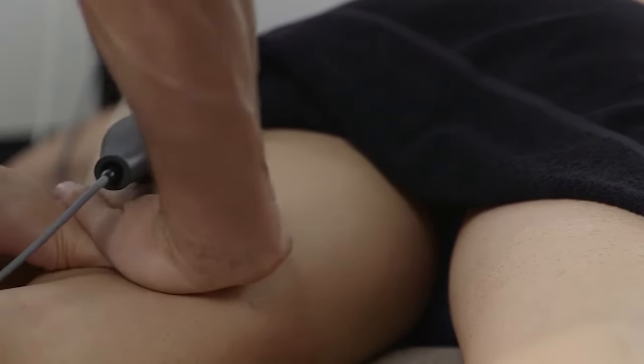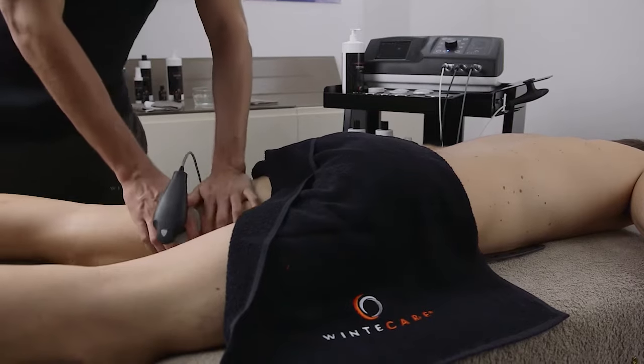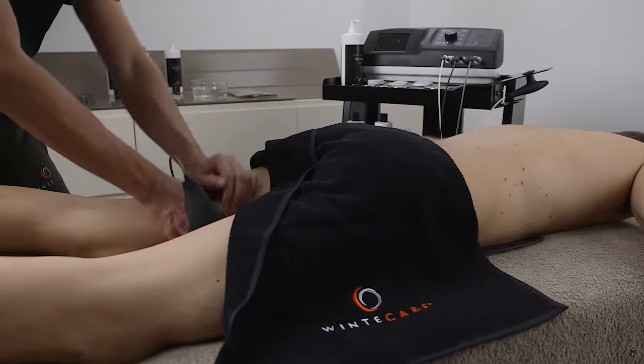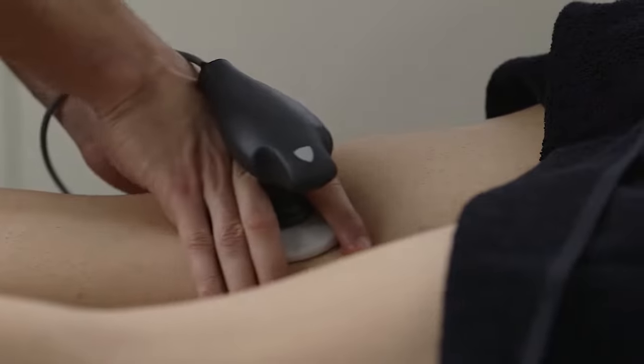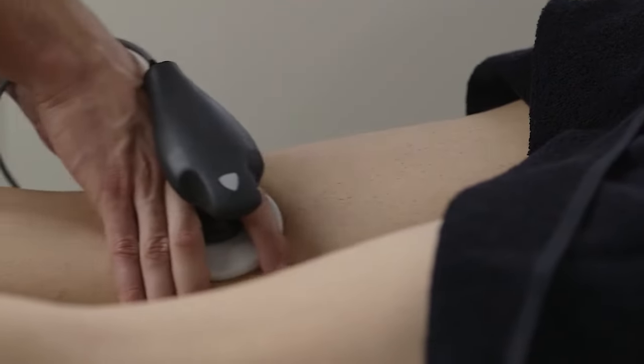The values shown on T Plus screen always refer to the energy actually absorbed by the tissue and not simply the supplied ones. This is a fundamental feature for every operator who needs to monitor and keep track of the therapies performed.